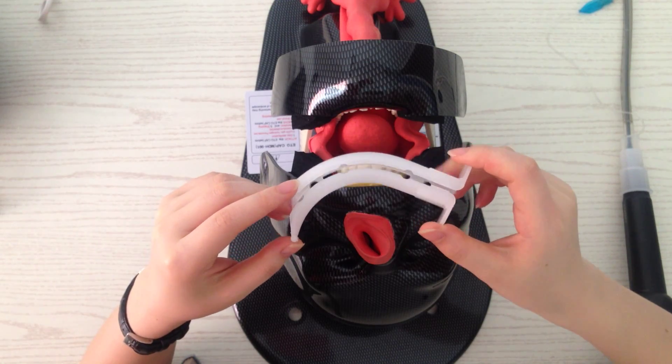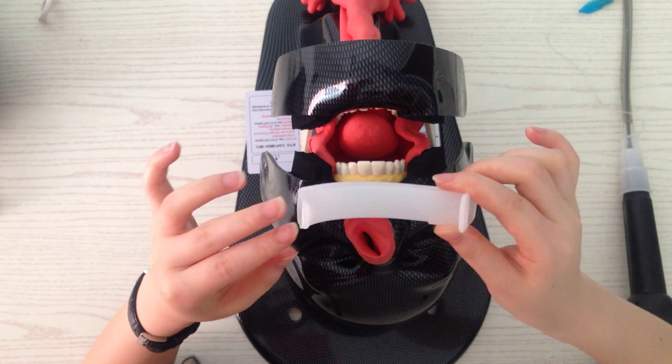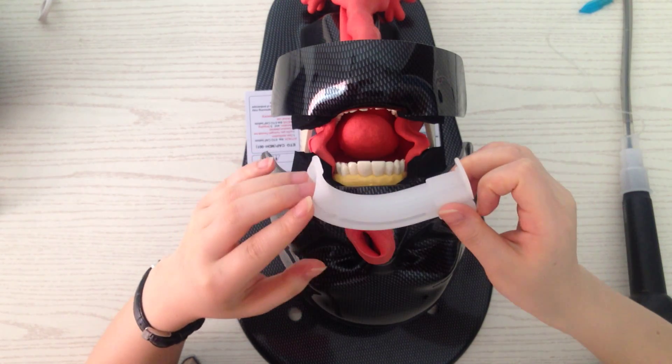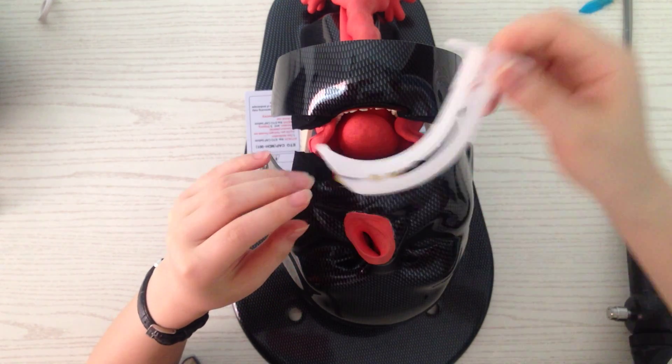This is the guide blade. It is to aid the patient's mouth and also to guide the first user for flexible scope like this.